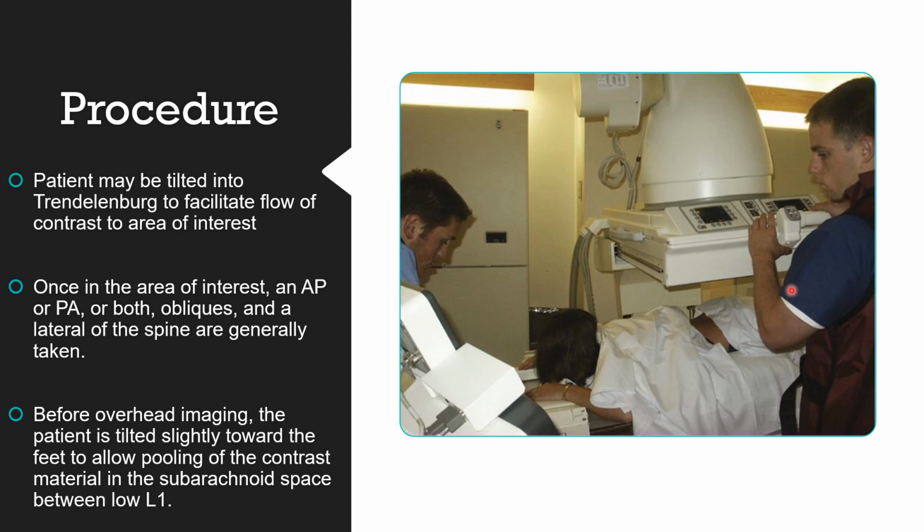Again, I believe this is just a general demonstration. If this was a real lumbar puncture, this would have a sterile drape on it, and the radiologist would have his sterile gloves on if he's about to do this procedure.